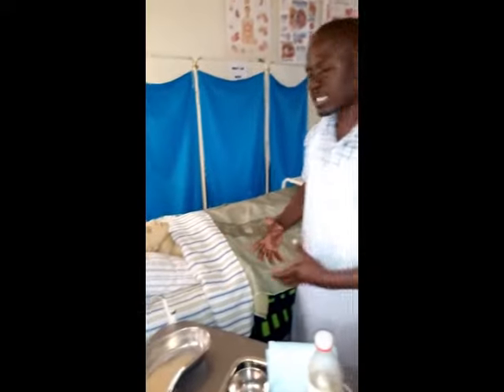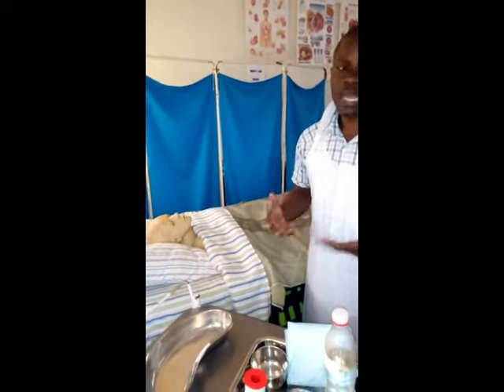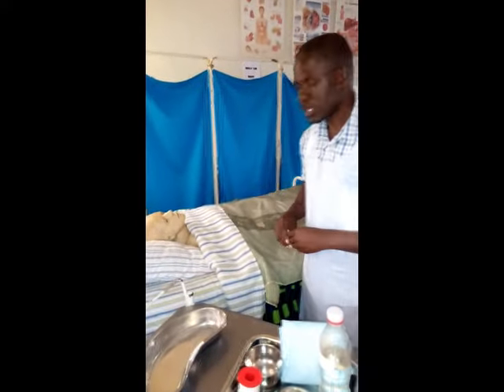After you greet, you introduce yourself, you even explain the procedure. Mrs. Mwape has to be asked to sit up. This procedure accounts for marks even on sitting. The patient has to sit up. Just to prop up the patient, that's a mark. So you just have to follow that one.